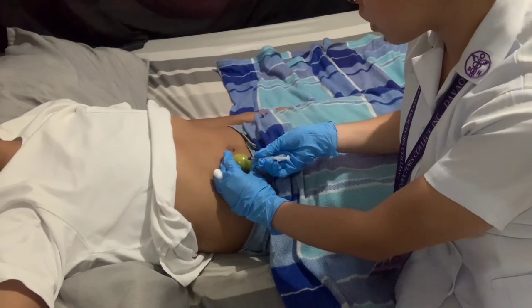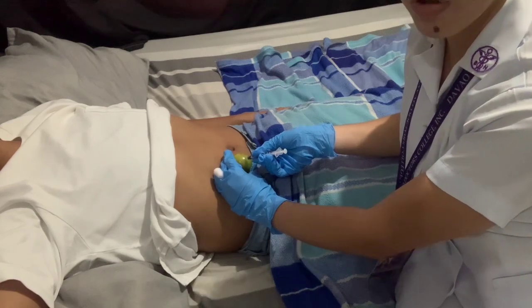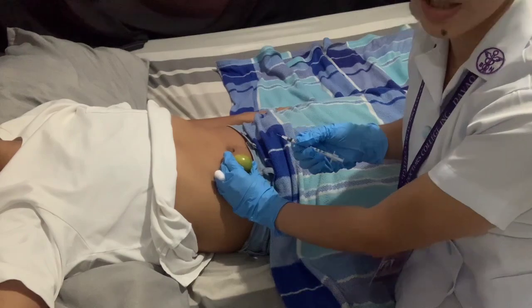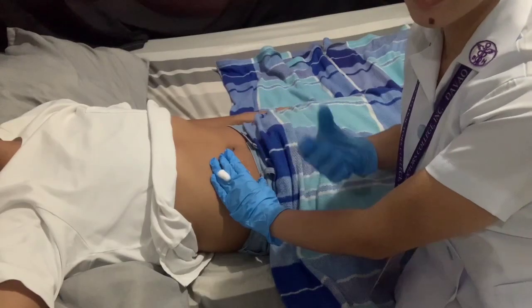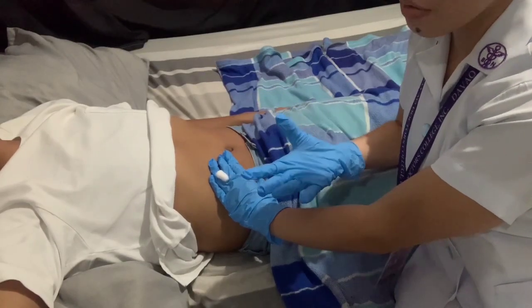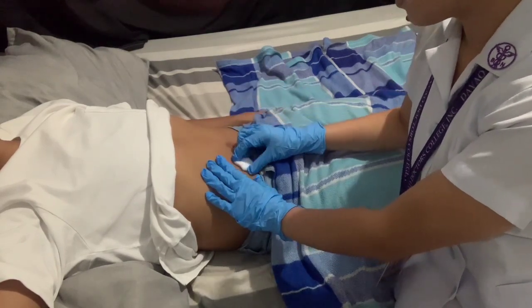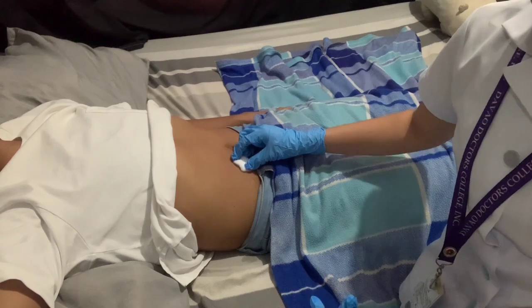Okay, so after that, we are going to withdraw the needle just like how we inserted it. Discard and place the syringe into the right receptacle, and then we are going to place the dry cotton ball into the site.